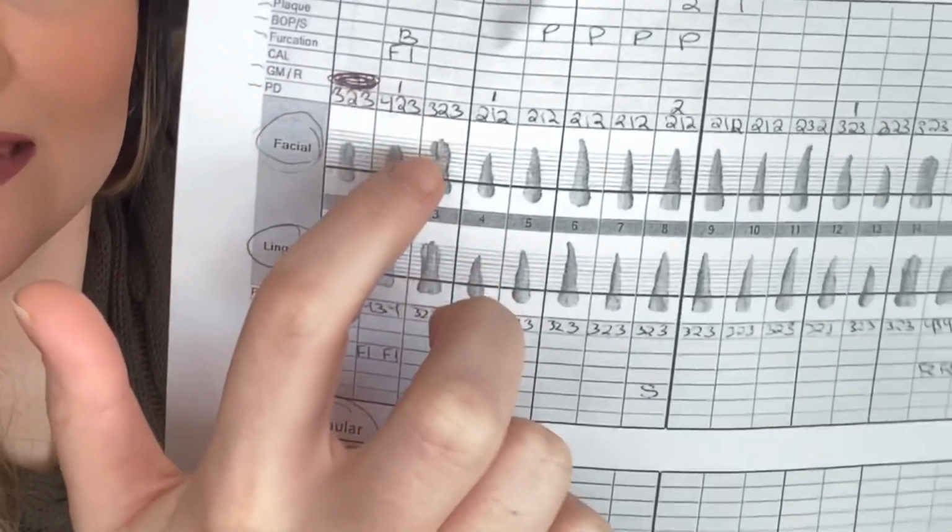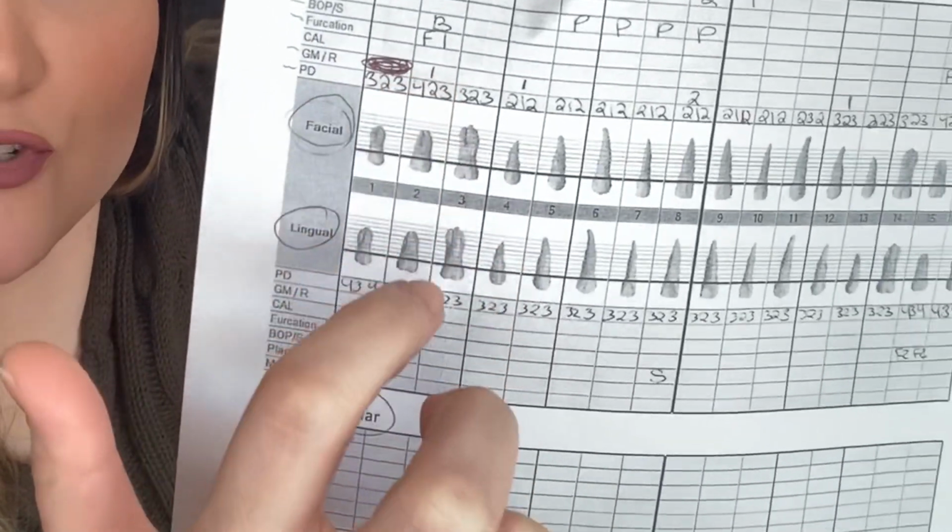That is in the middle of the line, you just put your little measurement because it's going to be in the center of the tooth. So you just put a 1, a 2, a 3, and usually the hygienist will say number 12 has 1 recession on the facial. And then number 13 on the lingual has a number 2 recession on the lingual side. They'll tell you where it goes, facial or lingual.